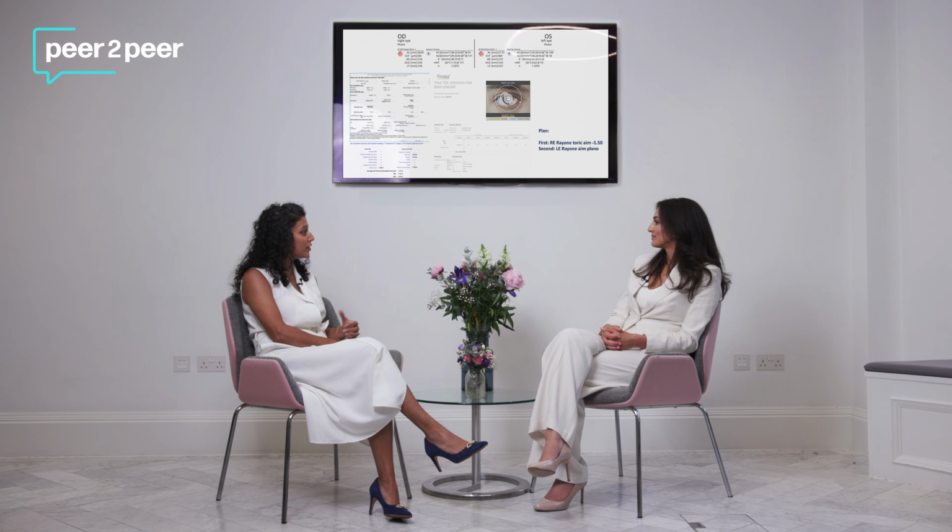Of course, with modern day biometry, you do have functionality where you can input that the patient's had previous LASIK, whether it's been for hyperopia or myopia, and it will give you a lens based on that. We also tend to use the ASCRS calculator, whereby you input as much information as you can, so pre-op CYLs, pre-op Ks, and pre-op refraction, and the immediate post-op refraction, plus the latest biometry, the today reading of biometry, and it gives you a selection of lenses to use.